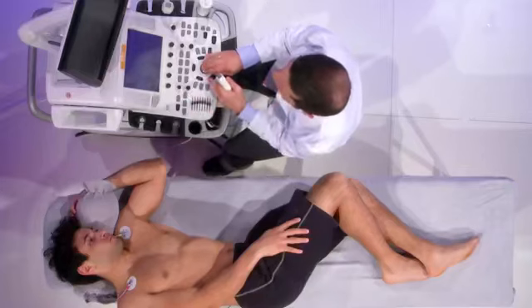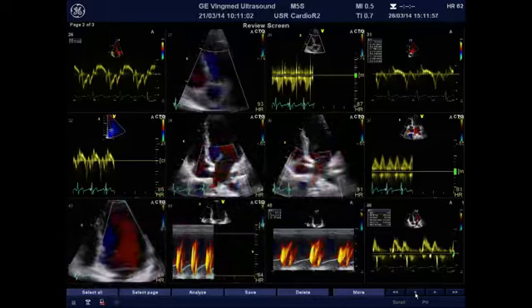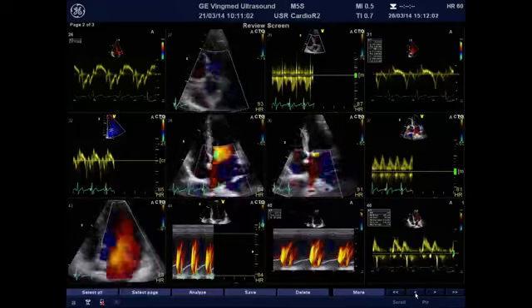But on the other hand, when the patient has preserved ejection fraction, we do not have so many options, and E/E' comes as the first choice to use in order to assess filling pressures in a patient with preserved ejection fraction. Finally, there is one more modality which is recommended in order to assess diastolic function, and this is color M-mode measurement of the flow propagation.